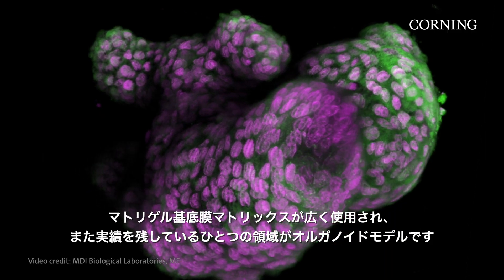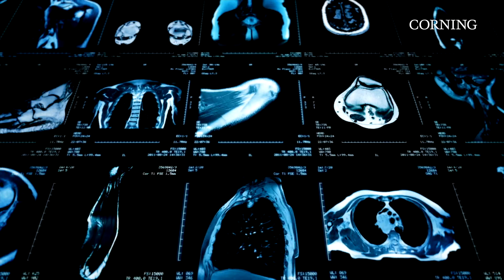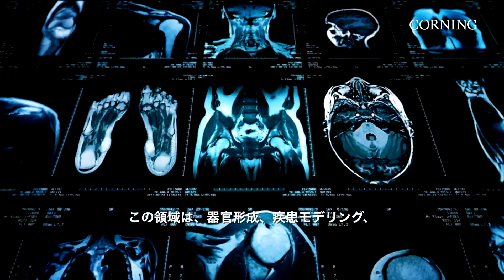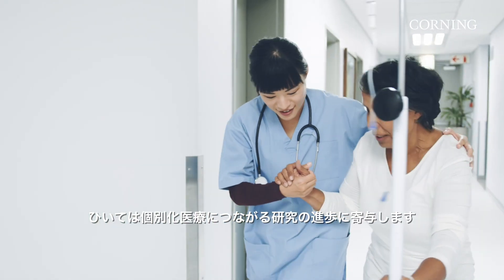One area that Matrigel Matrix has been widely and successfully used is in organoid models, an area of research that supports advancements in the study of organogenesis, disease modeling, and subsequently patient-specific therapies.